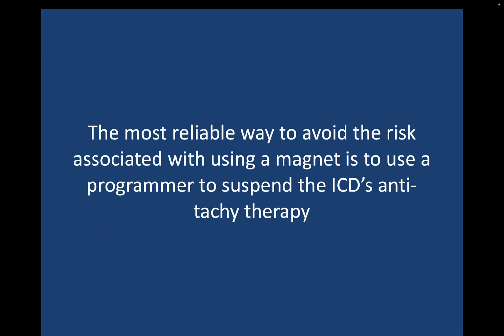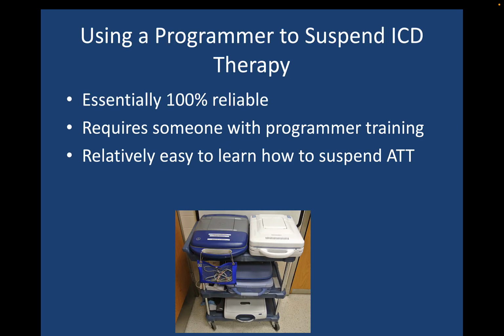Now, the ultimate, most reliable way to avoid the risk associated with using a magnet is to use a programmer to suspend the ICD's anti-tachytherapy. Now, of course, even though it's 100% reliable, it does require somebody with programmer training. That usually is the EP doctor or cardiologist. But in some centers, including at Mass General, anesthesiologists have learned how to use these programmers. And I will tell you that it's relatively easy to learn how to suspend the anti-tachytherapy certainly for 3 of these devices, for the Boston Scientific, the Abbott, and the Biotronic devices.